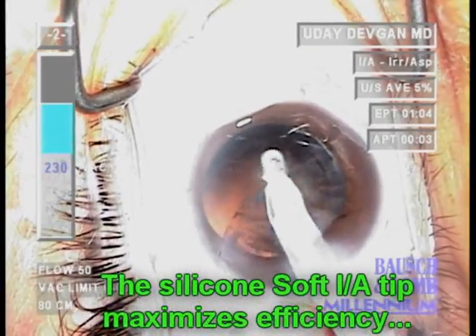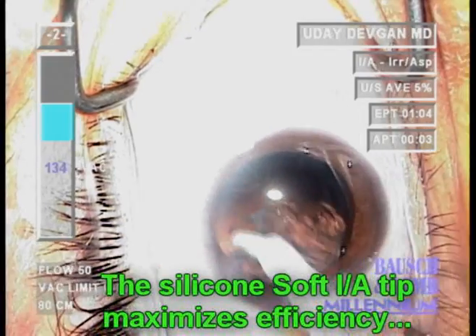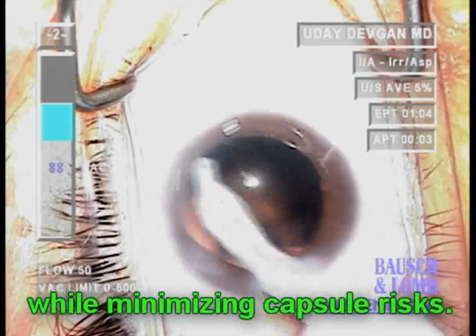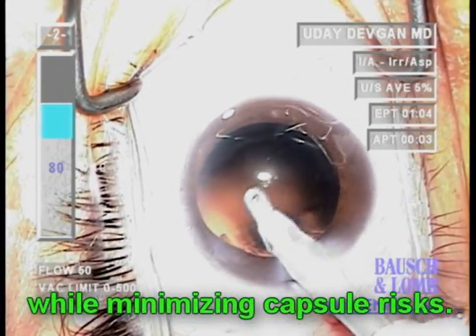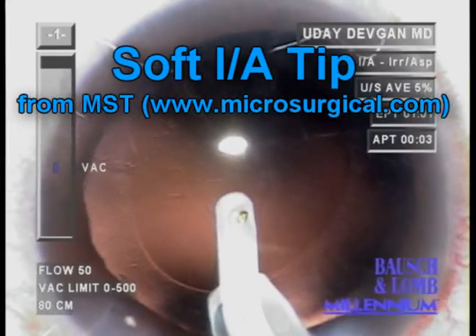Here you'll see complete cortex removal in about 15 seconds. At the same time, it minimizes risks to the capsule because of its soft and grippy surface. Due to these many advantages, I anticipate that using the soft silicon IA tips will be the trend for future cataract surgery.